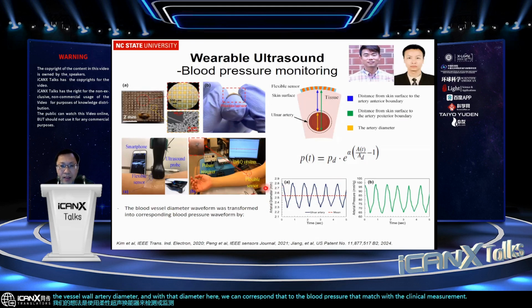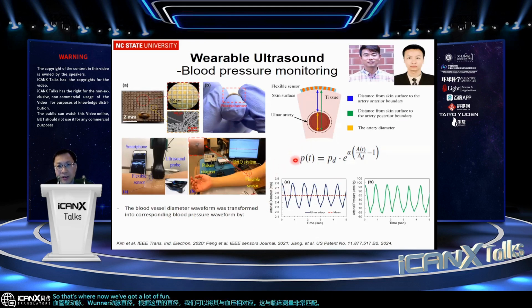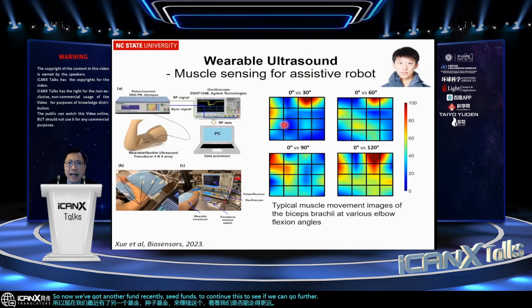So that's where we now got another fund recently, seed funds, to continue this to see if we can go further. This work is about wearable ultrasound using those flexible ultrasound transducer arrays to monitor the muscle continuously. This is led by Dr. Xiaoning Xue in our lab, collaborating with Professor Nitin Sharma in the BME department.